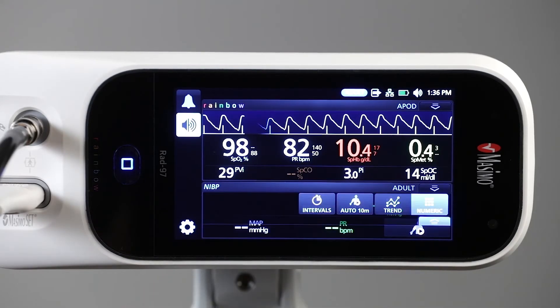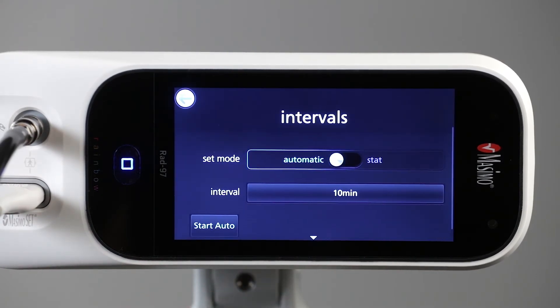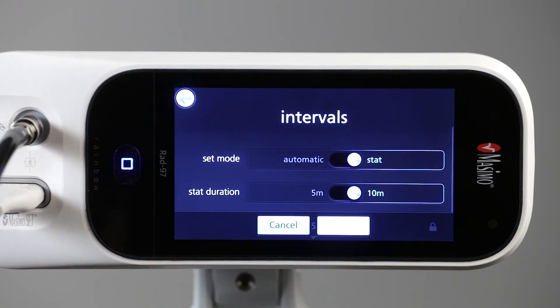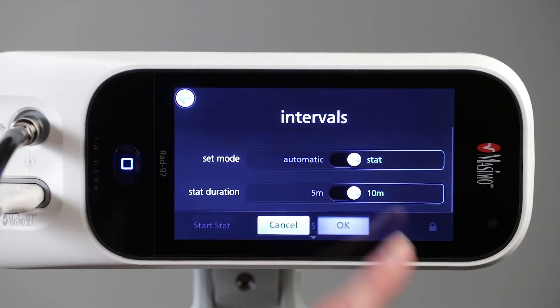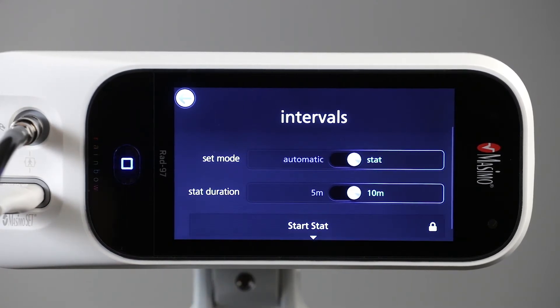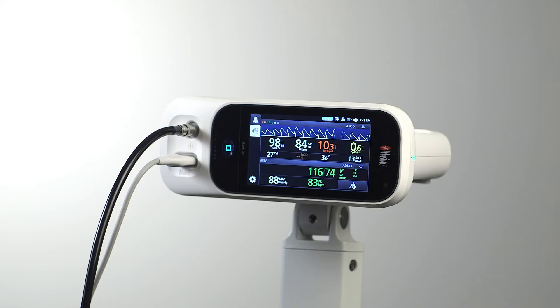Stat interval mode takes NIBP measurements continuously for either five or ten minutes as selected by the clinician. Simply select the time interval and press 'Start Stat.' A spot check NIBP measurement can also be taken at any time by pressing the start button.